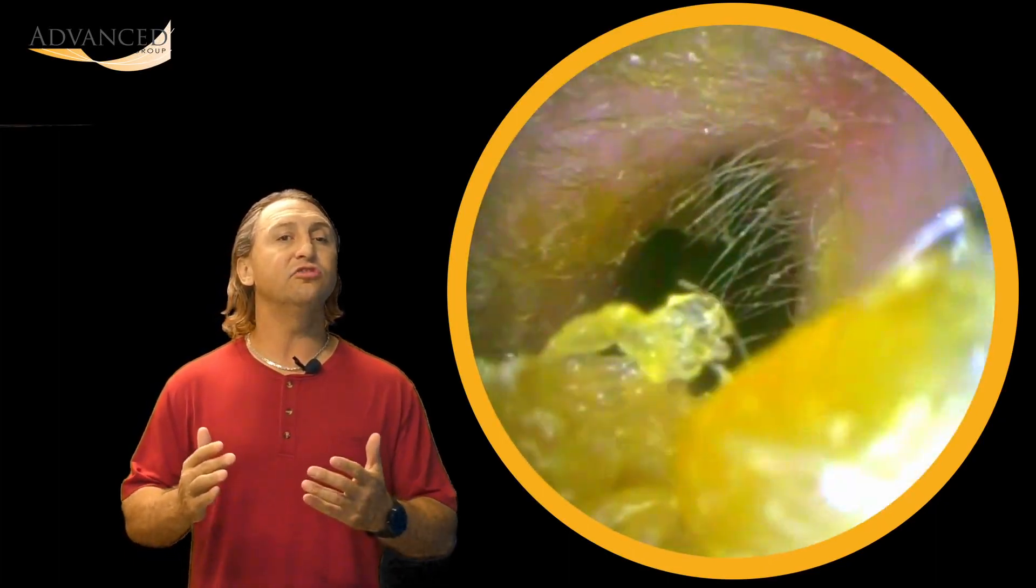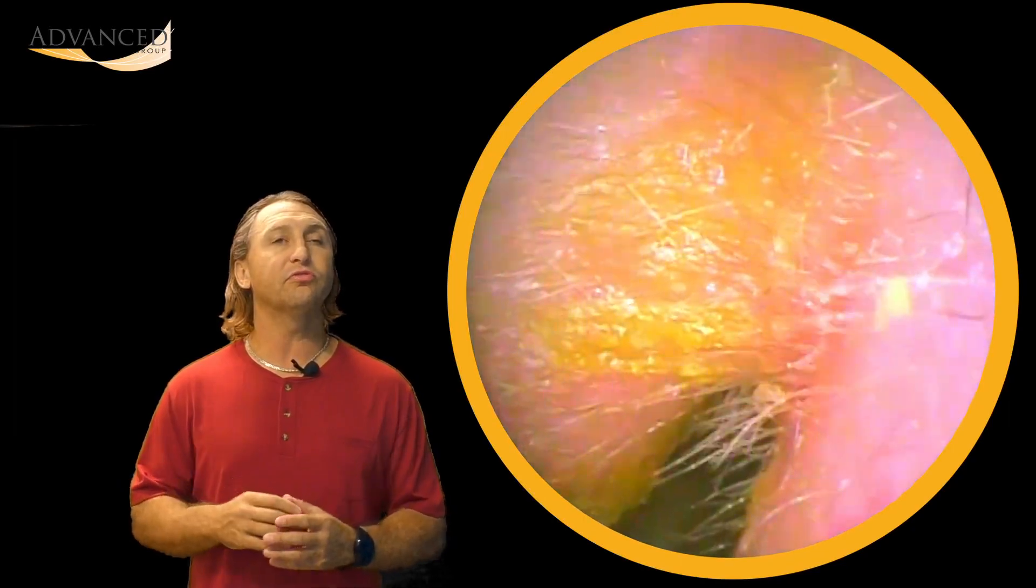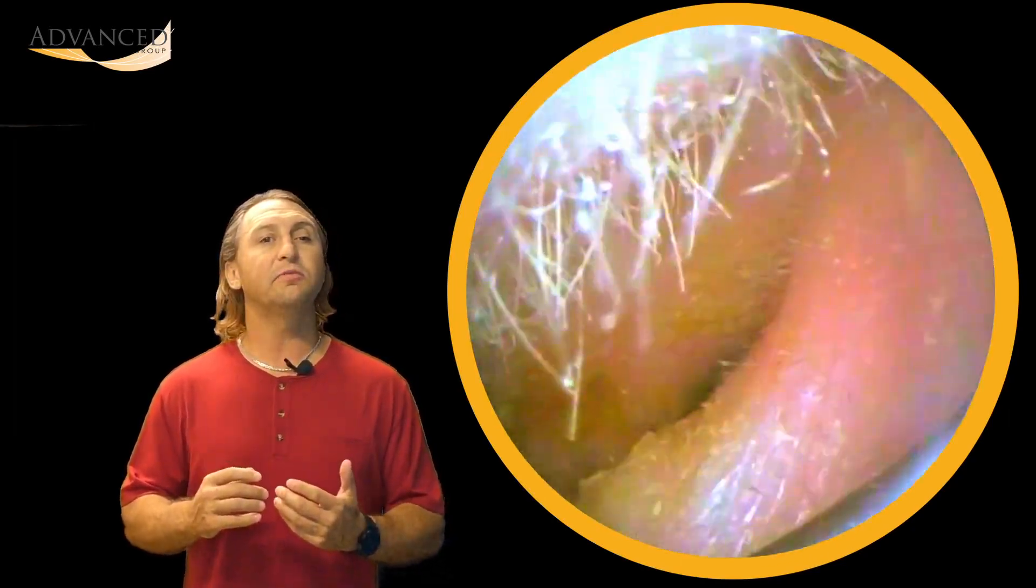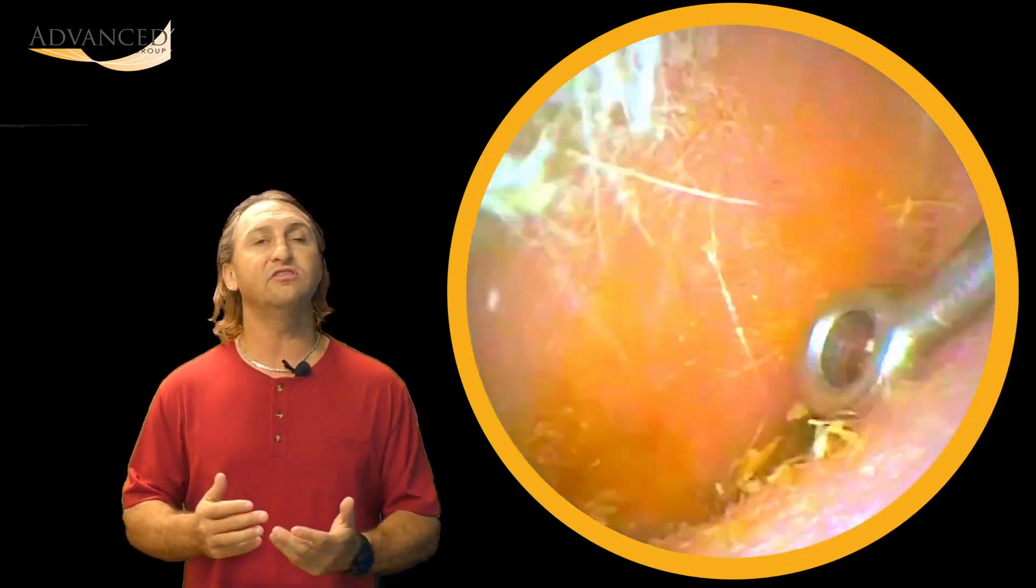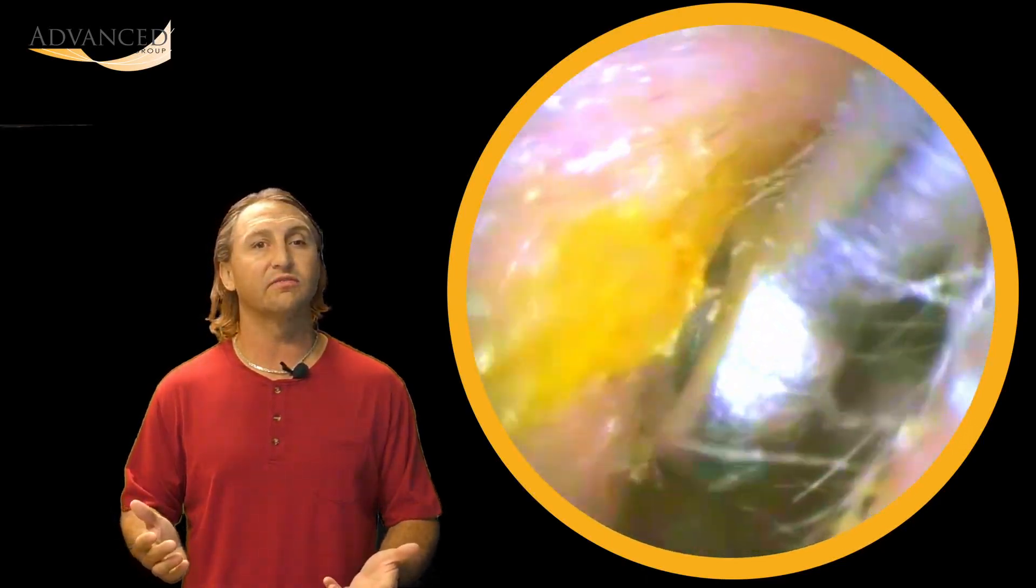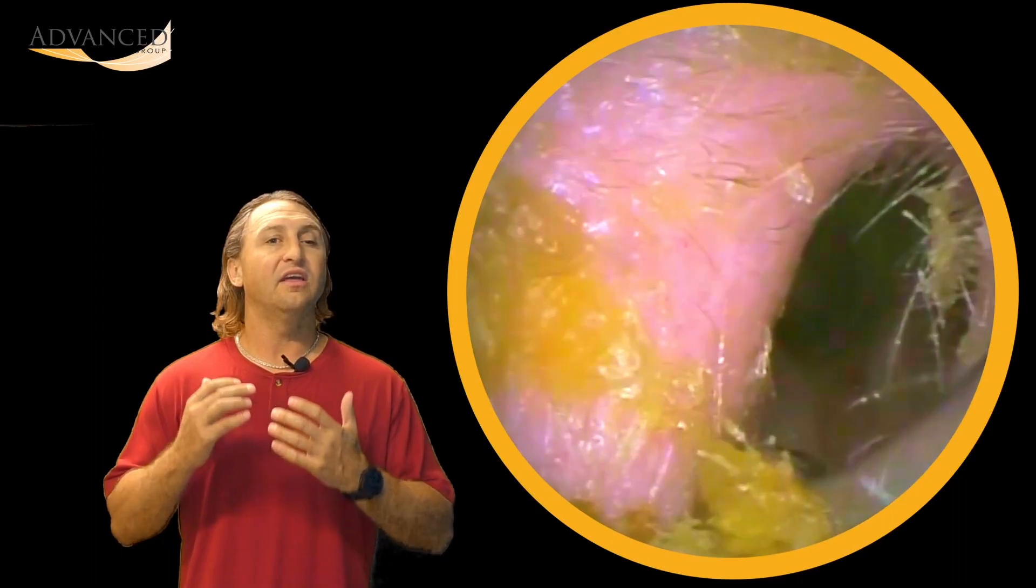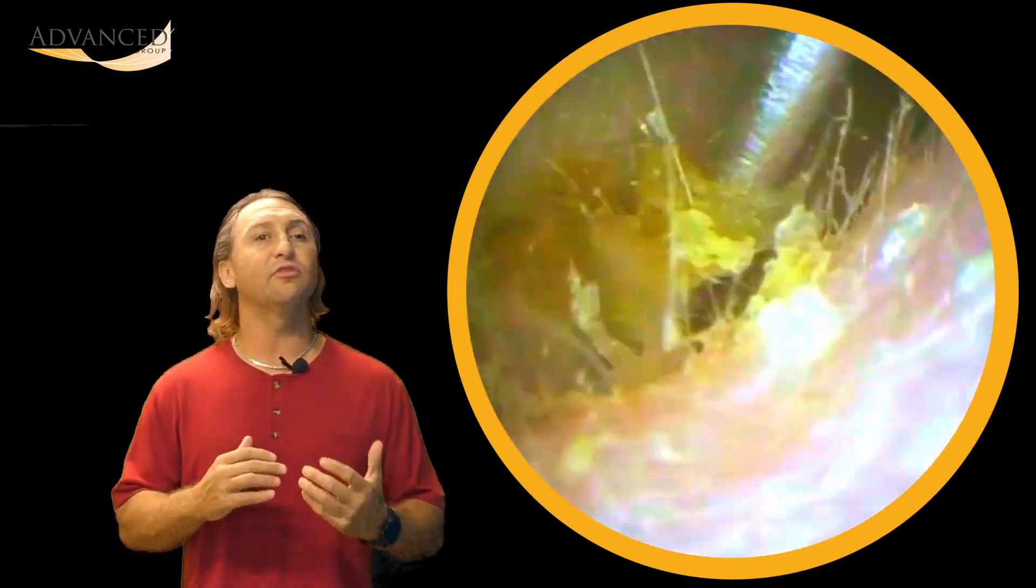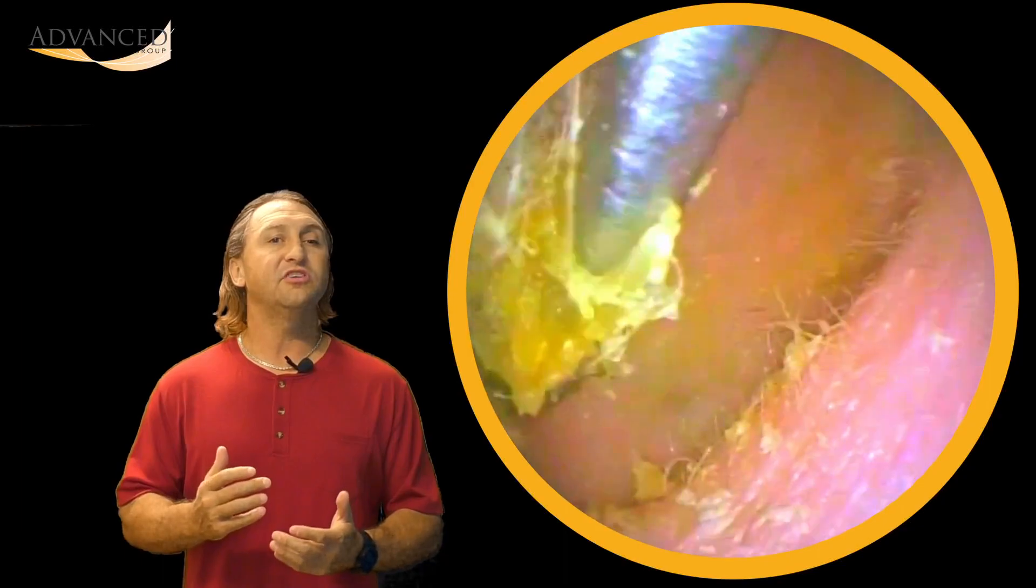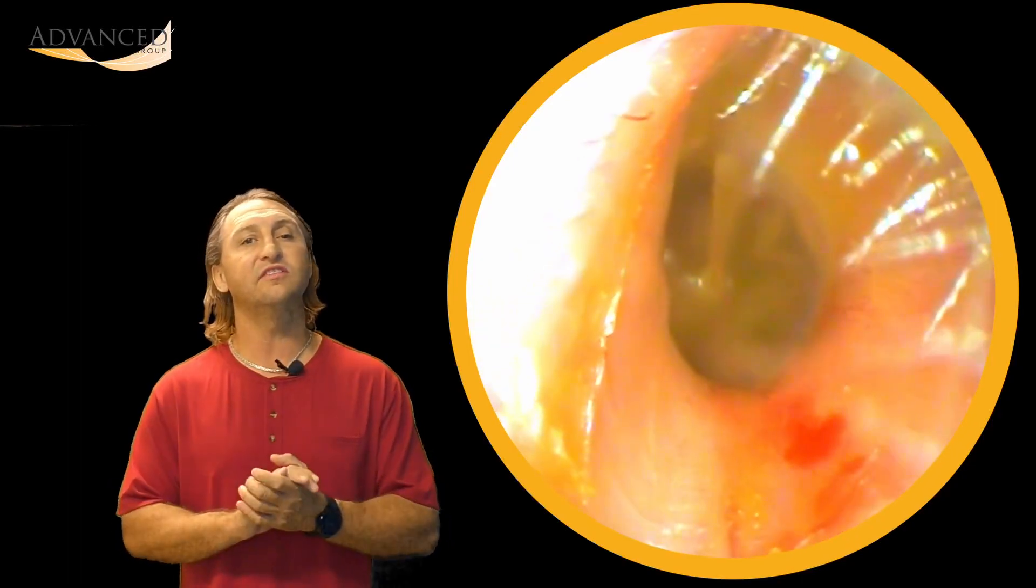So as we remove that wax, as soon as we opened up the ear canal and broke through that wall of wax, they experienced an immediate increase in the amount of sound that they could hear. I'm always fascinated by the amount that earwax affects different people. In this patient's case, there was a great effect, and as we look down, you can't see the ear canal at all. We get through there, now we can see the eardrum.